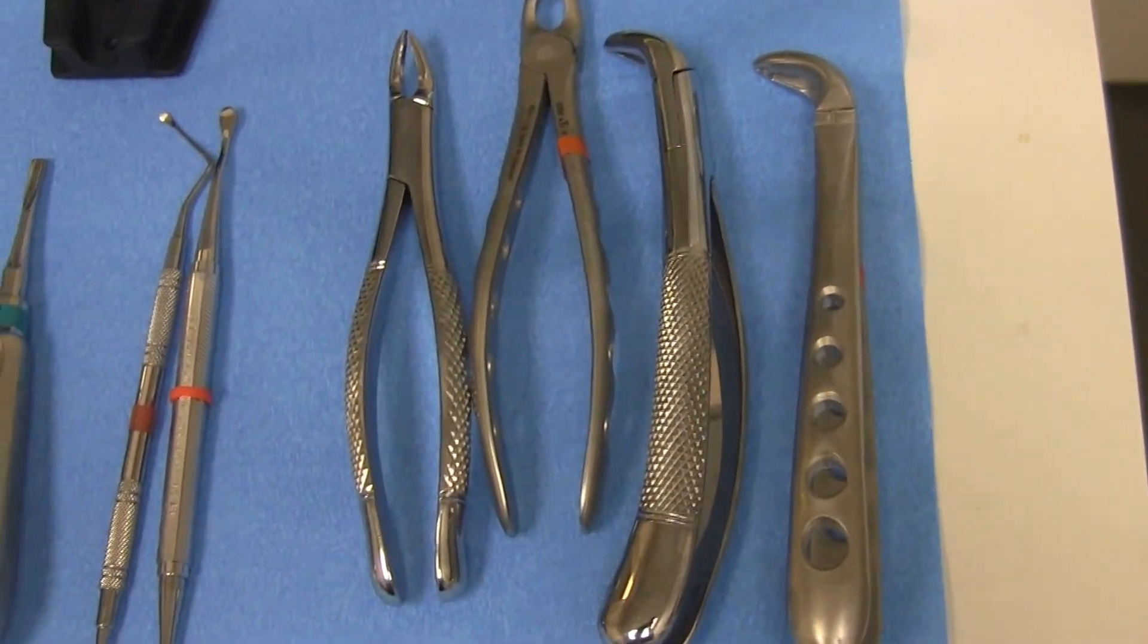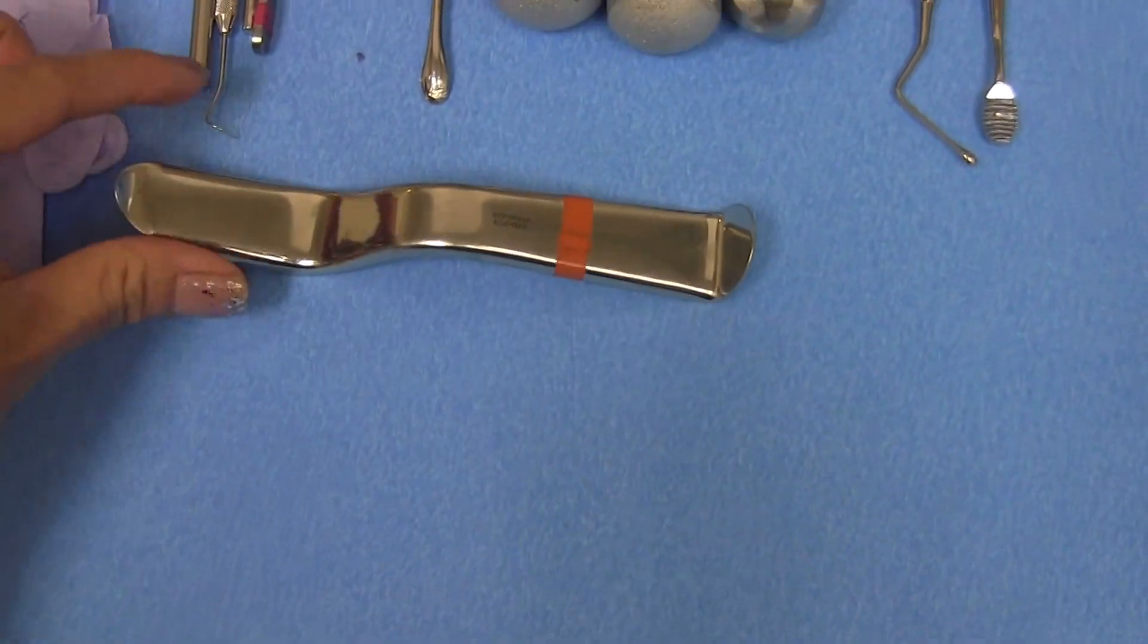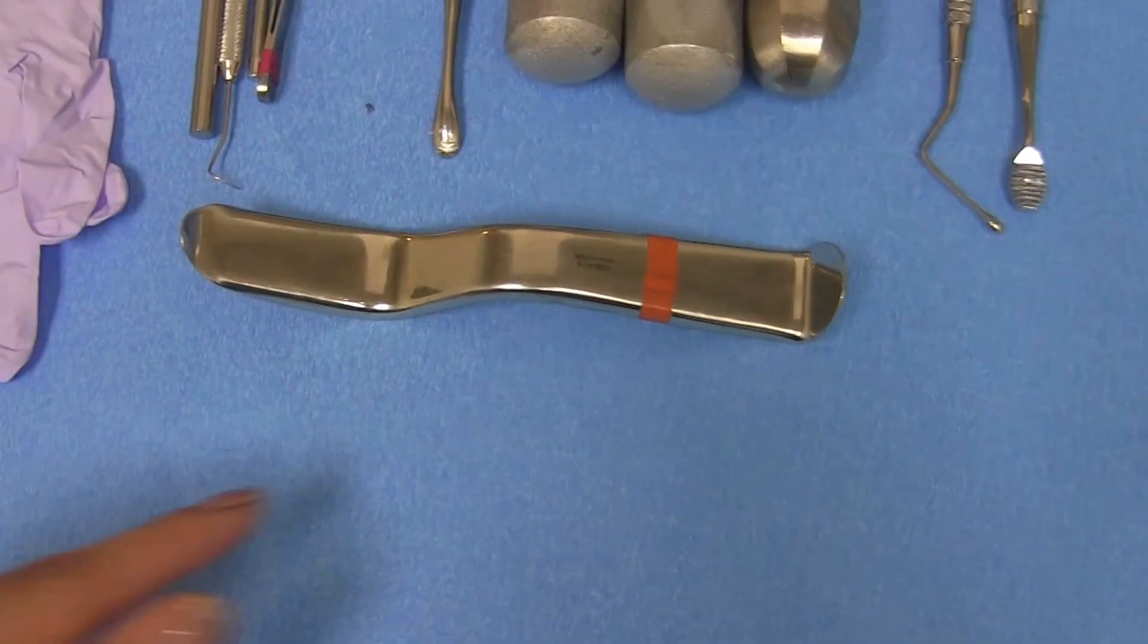Some other specialty items you also want to get familiar with is the cheek retractor, which can sometimes help if we're working on posterior teeth.